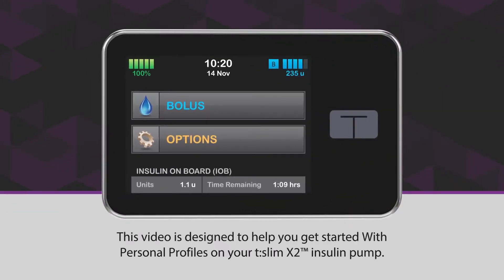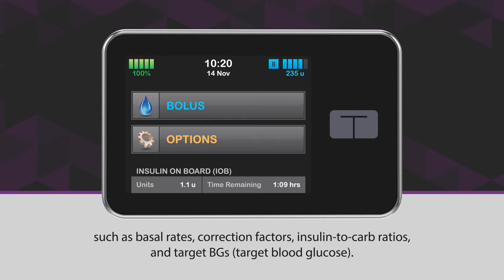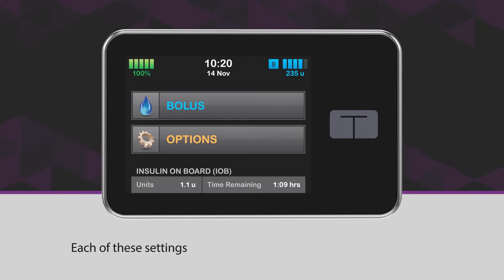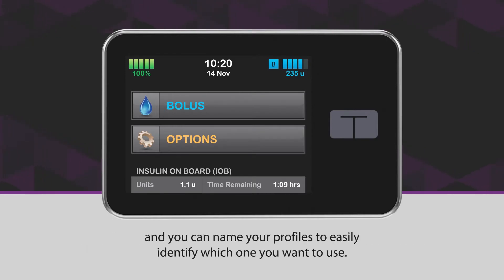This video is designed to help you get started with personal profiles on your T-Slim X2 insulin pump. Personal profiles are where you program settings related to insulin delivery, such as basal rates, correction factors, insulin to carb ratios, and target BGs. Each of these settings can be adjusted for different times of the day, and you can name your profiles to easily identify which one you want to use.